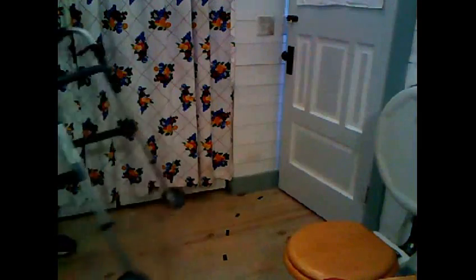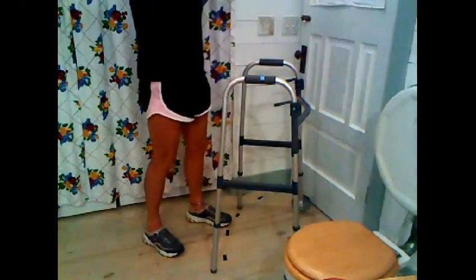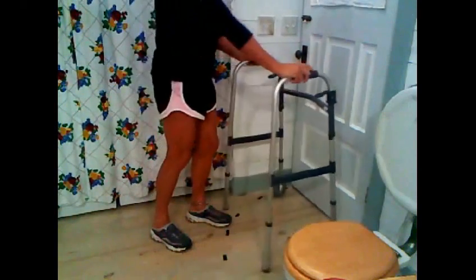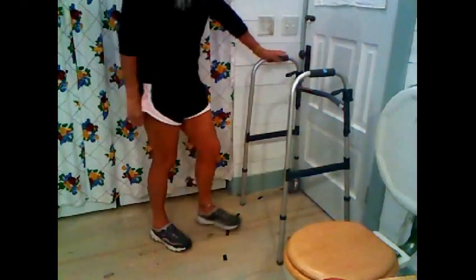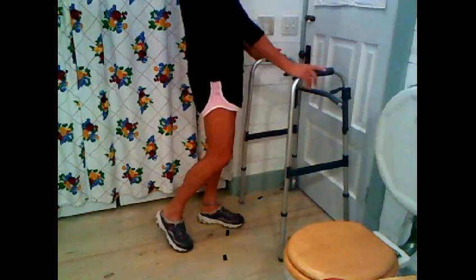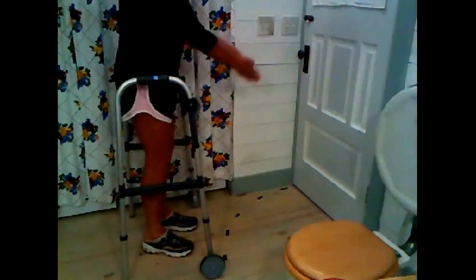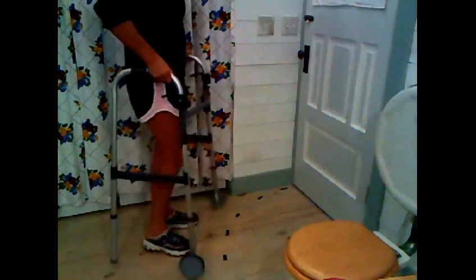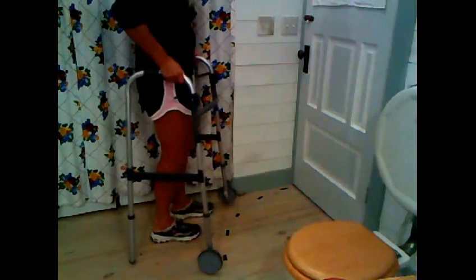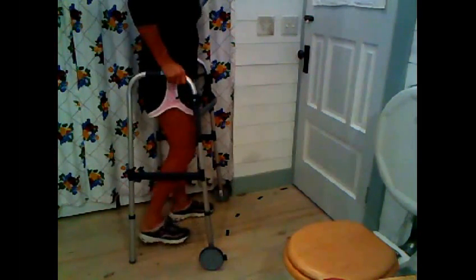Now we've got this monster, and I wanted to make sure that I got a good wide one here so that it's really difficult. So we have an inward opening door, and we have a walker that is this big. How are we going to get that thing out? Again, you're going to be thinking in terms of the door swing. You're going to take and put your walker at an angle about like this, or as close as you can to what you think that door swing is going to be.